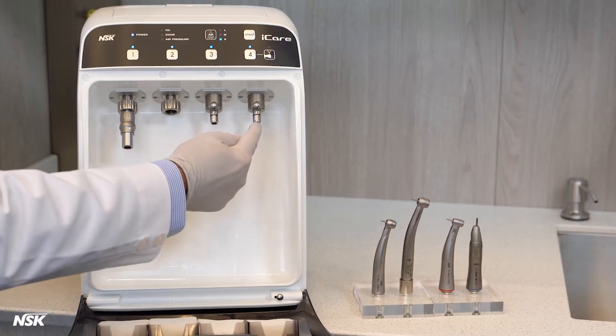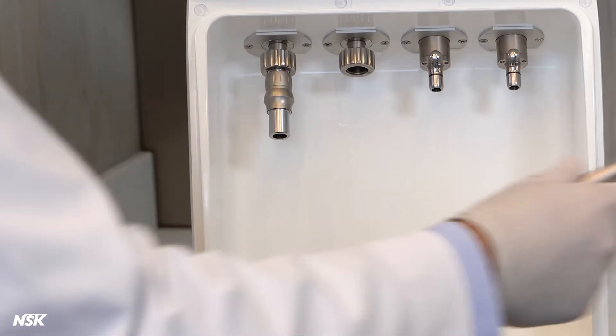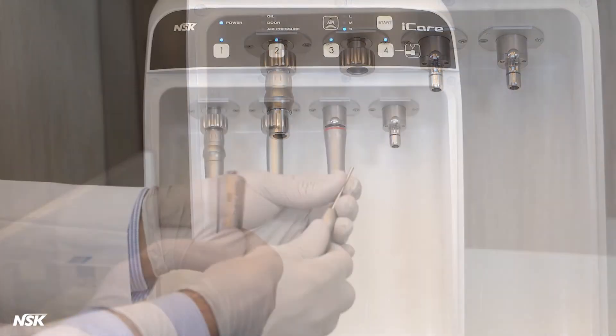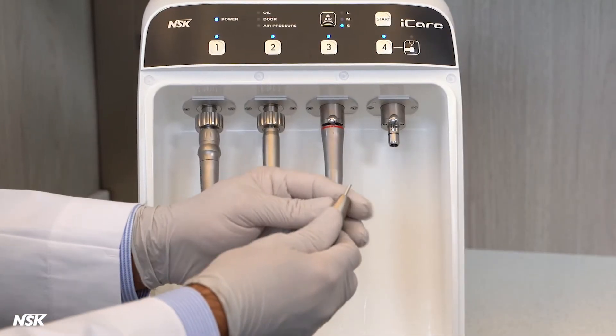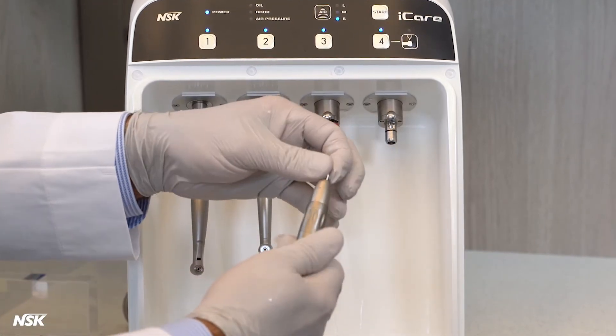Port number three and four can be used for electric or air-driven E-type attachments. Be sure to remove the burr for high or low-speed handpieces. The only exception is the E-type straight nose cones — the dummy burr needs to be mounted on these handpieces so they can rotate while being lubricated.